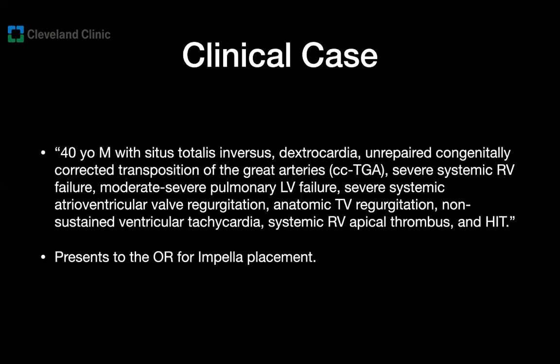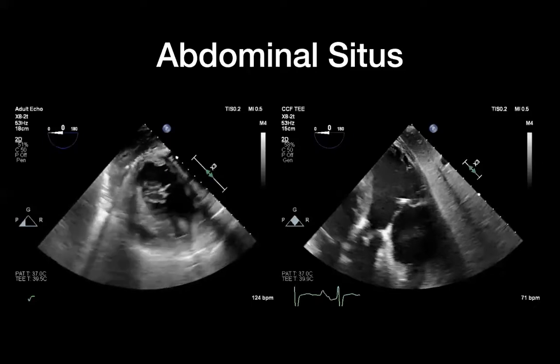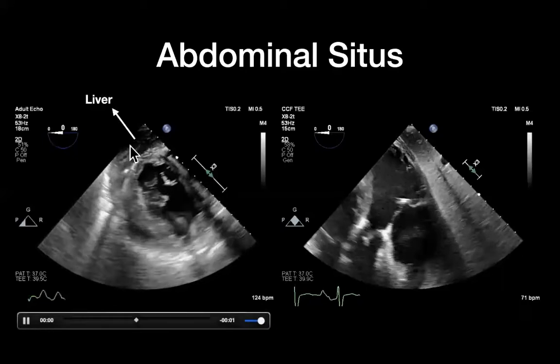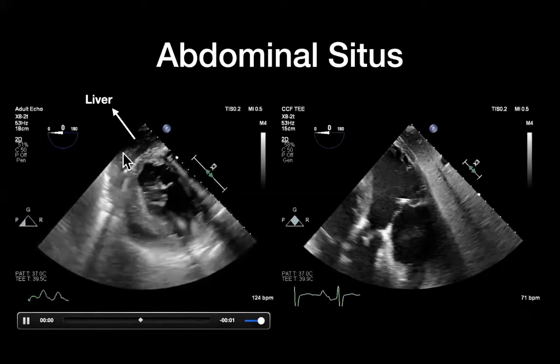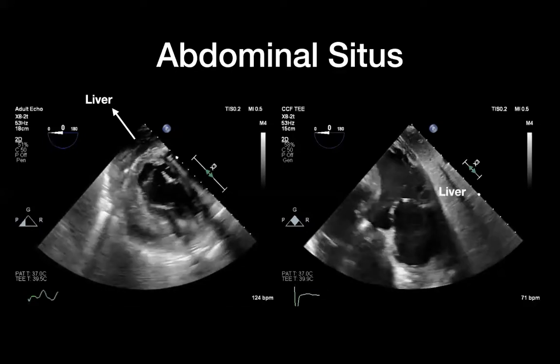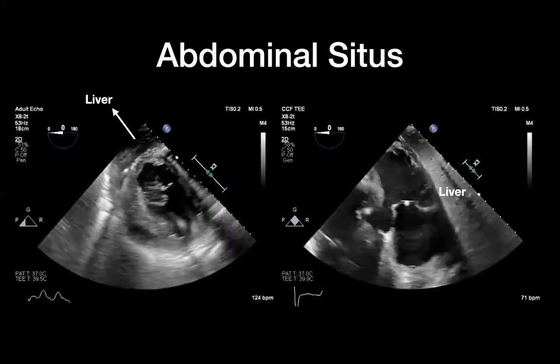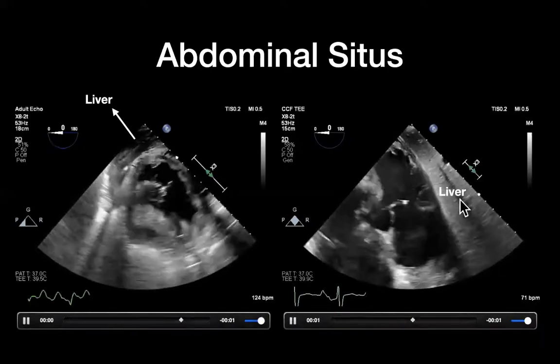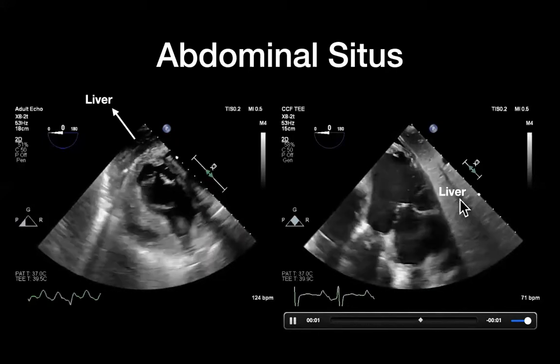Now let's go back to our clinical case and apply these concepts. The transgastric view of the base of the right ventricle on the left shows that there is almost no liver here — this is the morphologic right ventricle, you see a tri-leaflet valve, and there is very little liver; we should see a lot of liver close to that right ventricle. Now look at the deep transgastric view: the liver is on the right side of the display, which is the left side of the patient. This means most likely the abdominal situs is inversus.